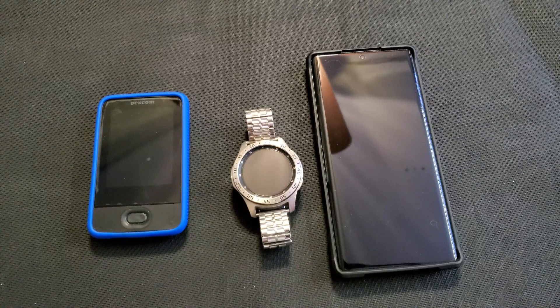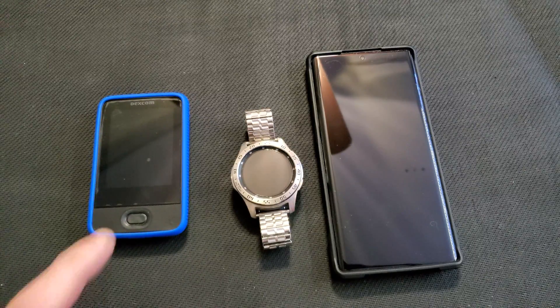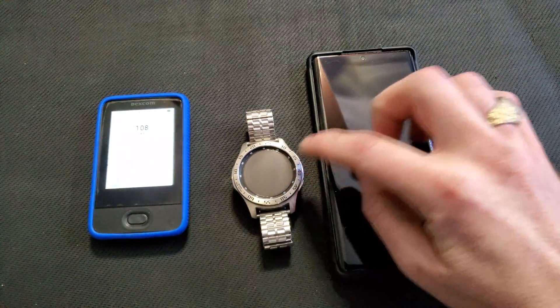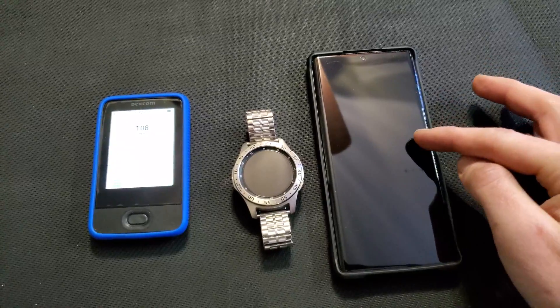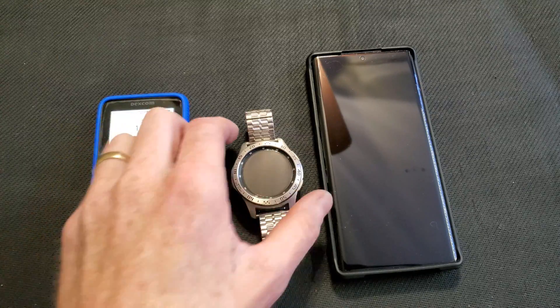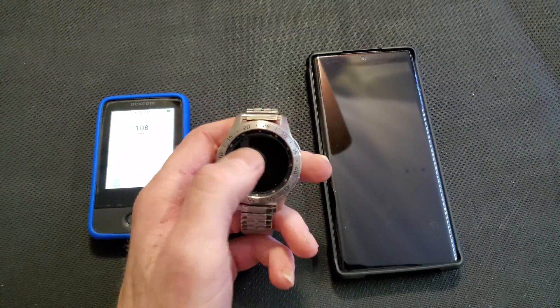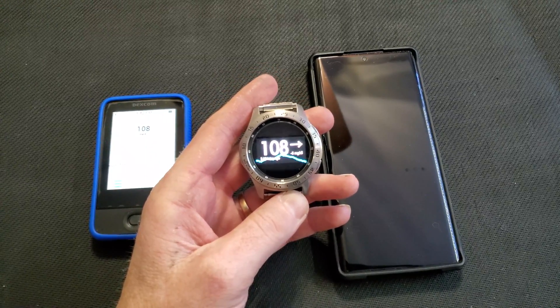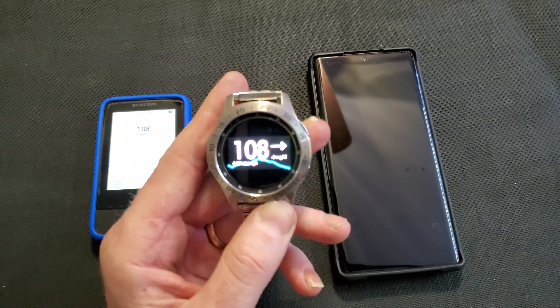Hey everybody, how's it going? So really quick, I'm going to show how you can get your Dexcom G6 to work on your phone — most people know how to do that — but I'm also going to show how to get it on your Samsung watch. This is my Galaxy watch, and you can see I have my reading right there on my watch.